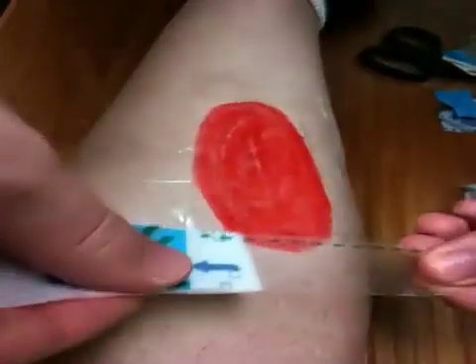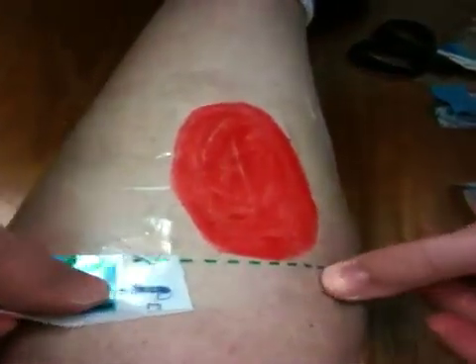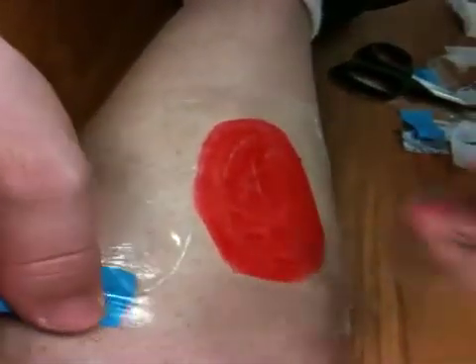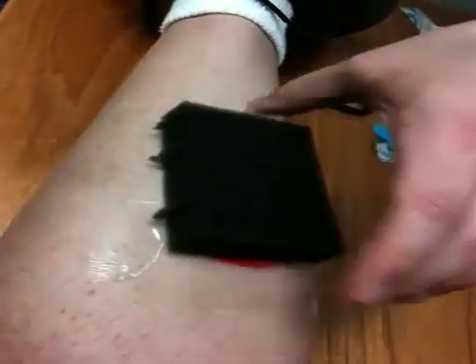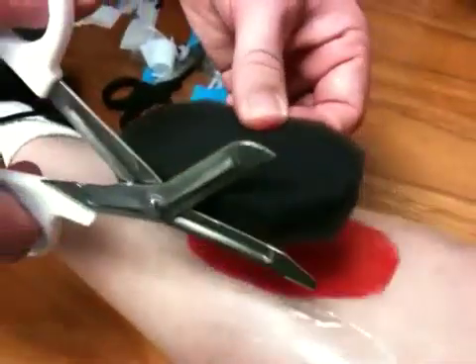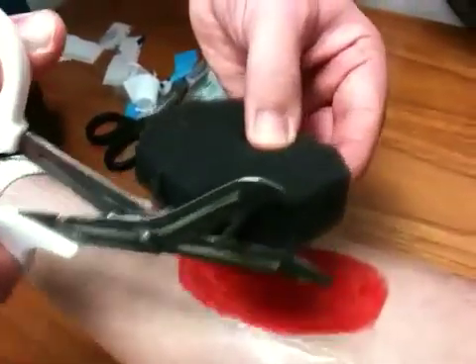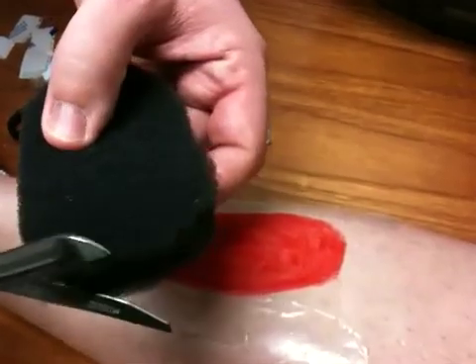This is helpful for wounds with irregular borders, the need for bridging two or more wound beds, and to prevent excessive contact between viable surrounding skin with the foam sponge. In addition, we recommend precise trimming of the foam with shears or even a scalpel blade.